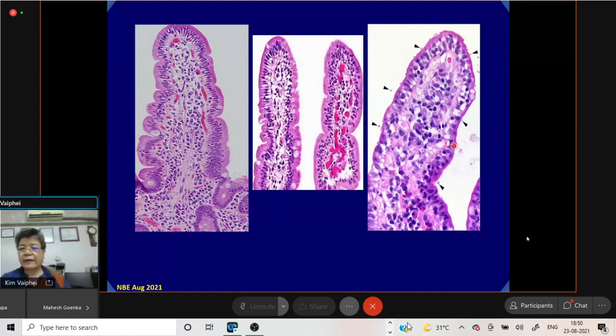Okay, I'll do this. There are 3 pictures of variable grades of increase in intraepithelial lymphocyte. Here, this is also increase, and another way, increase in intraepithelial lymphocyte is an inflammatory process. It is a T cell mediated inflammatory process. So the inflammatory process will not happen isolatedly. So increase in intraepithelial lymphocytes will not happen isolatedly. There would be other changes as well.